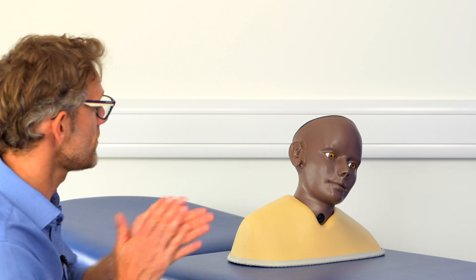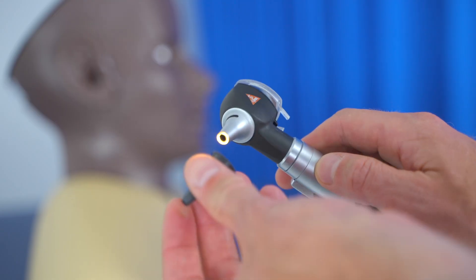So to start off, I'm going to gel my hands and then I'm able to get the otoscope.